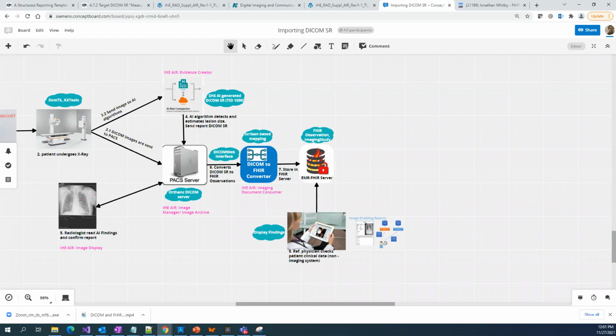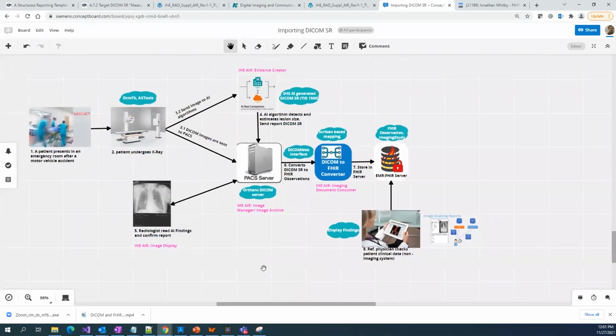Any display we could show it. All the CDS applications will use this kind of component actually. So this is the component which we are going to develop. Now you are able to connect what is IHE, what is IHE AIR, what are the use cases, what are the actors, what is a workflow, and then how we are going to do it in our Connectathon workflow. So this is one part of it.